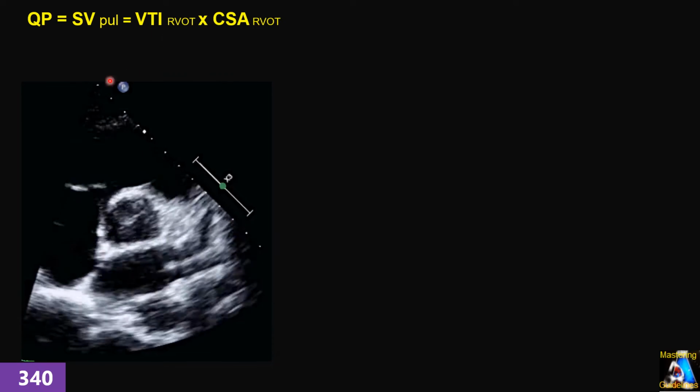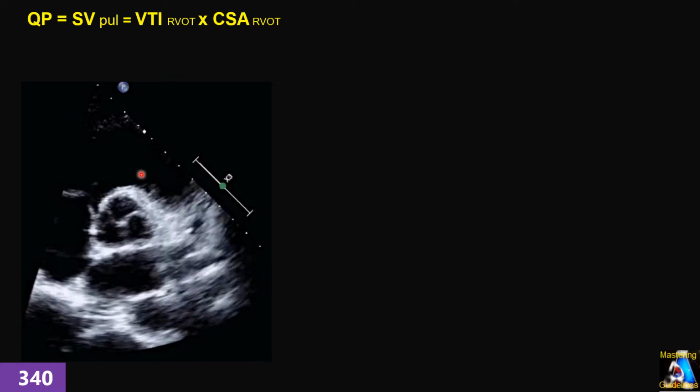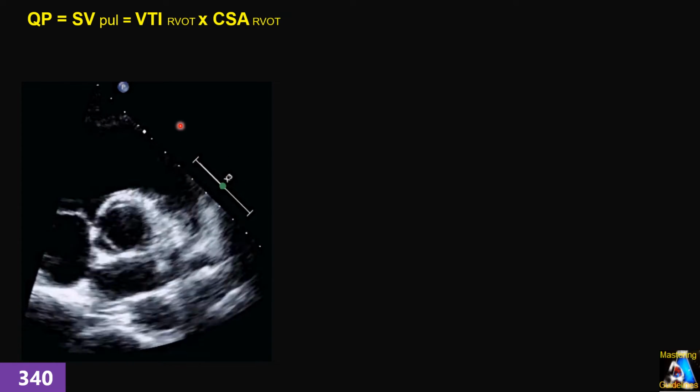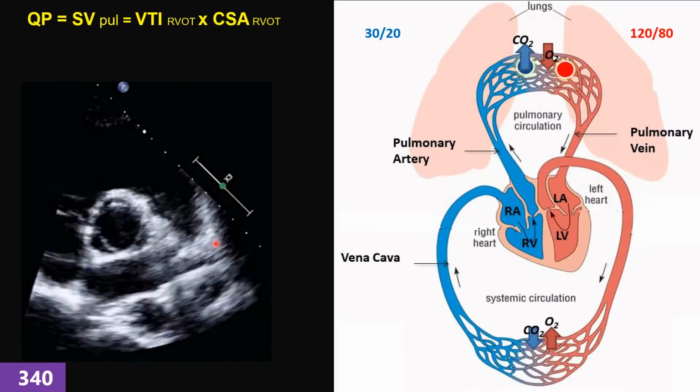we know that QP is used only for the intracardiac shunt, or are there some other clinical implications for measuring QP.